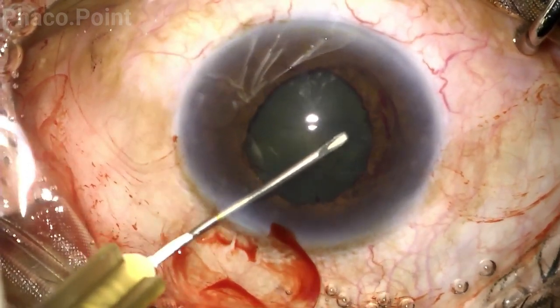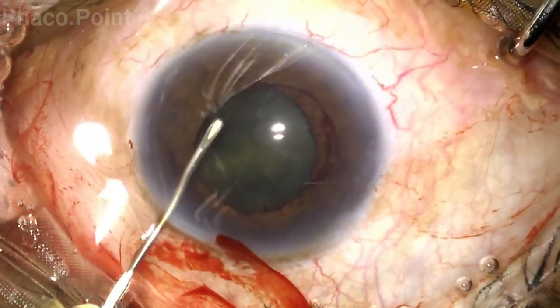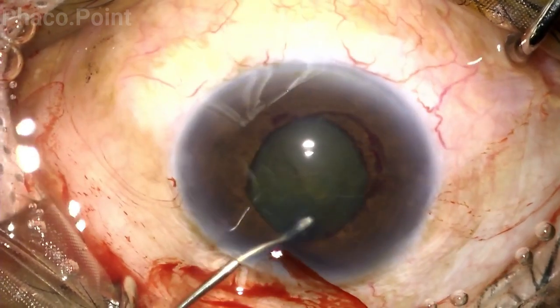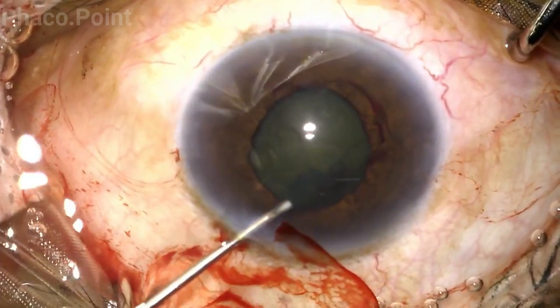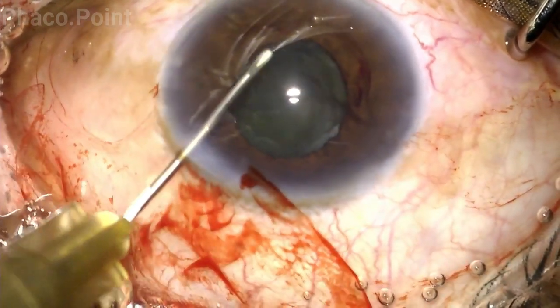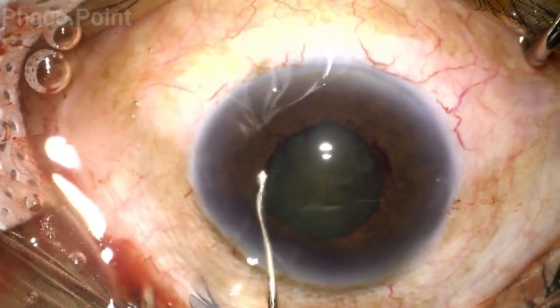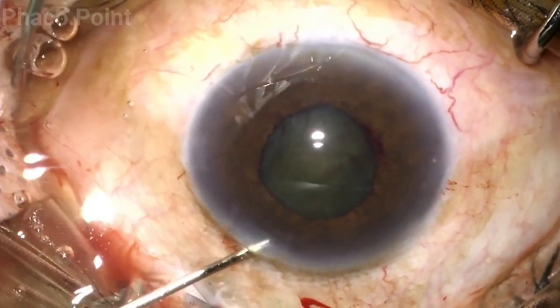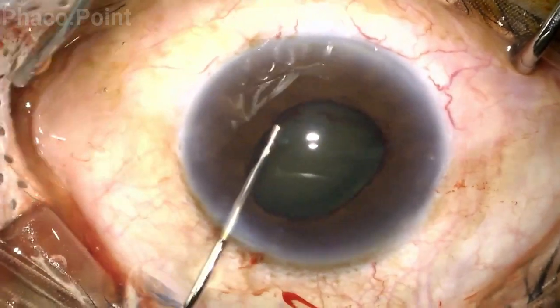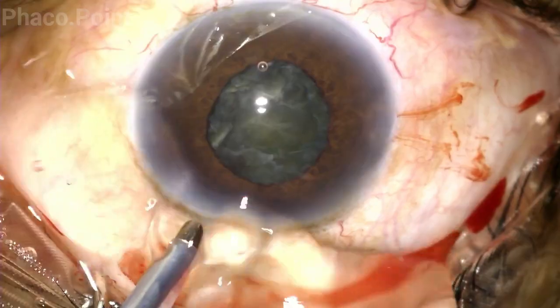When faced with a smaller pupil, I like to keep the capsulorhexis so that it is well within the pupillary margin. This helps because when you end up using fluidic forces like performing hydrodissection, all of that causes minimum ruffling of the pupillary edge, which could further reduce the size of the pupil. The hydrodissection needs to be careful, slow, and controlled, and once the surgeon confirms rotation of the nucleus, you're ready to perform the nuclear emulsification.